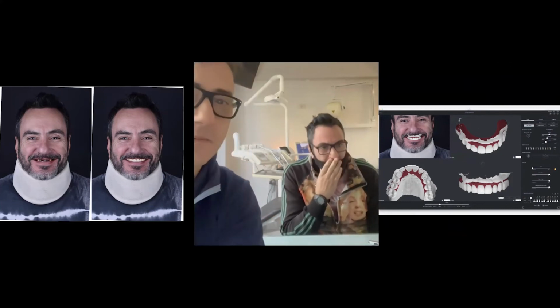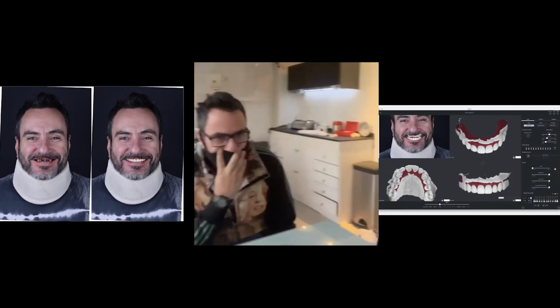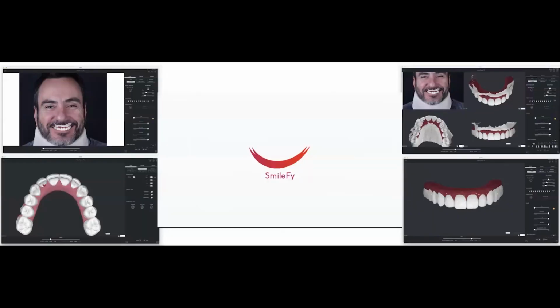Ralph made this, okay? We work together. You can work together with Ralph or other people through the app. You can choose one designer for you, and it's done.